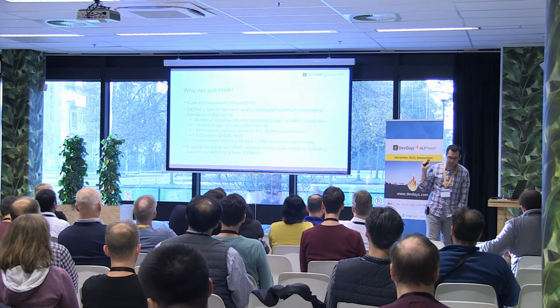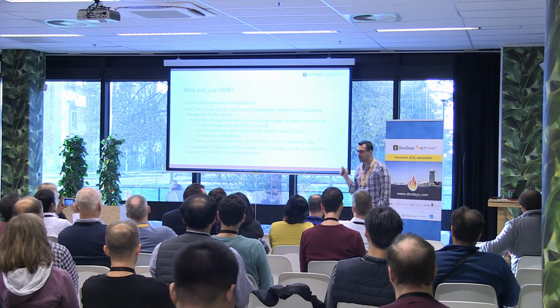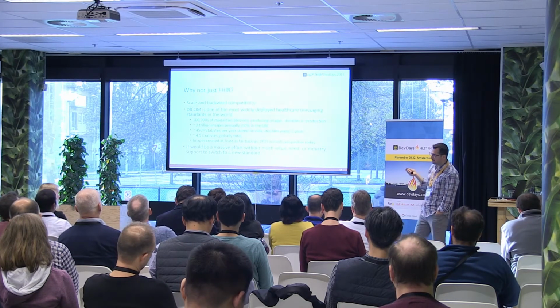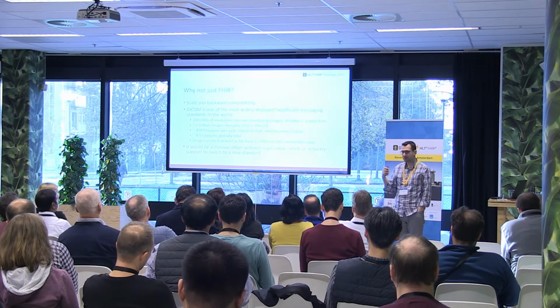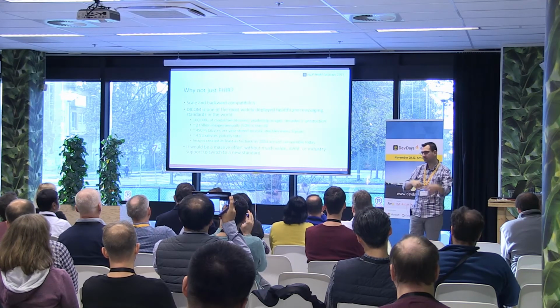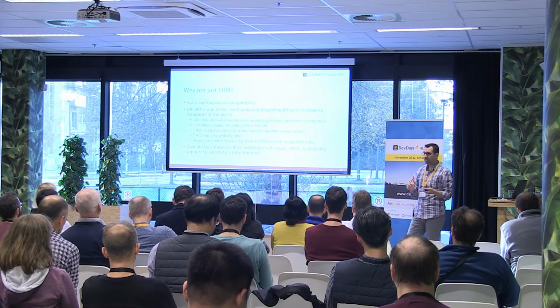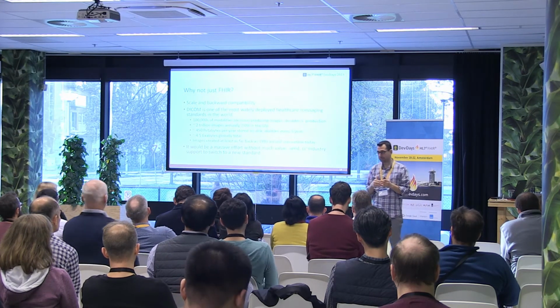Of course, the million-dollar question that I get at a conference like this is, why can't we just put this in FHIR? Like, why couldn't we just store the images in FHIR? A lot of reasons. One of them is, if you think about FHIR itself to begin with, FHIR is a complete reboot of HL7, right? There's no backward compatibility whatsoever between FHIR and V2. You could talk all day long about mapping between V2 or V3 and FHIR, but it's just not the same. Whereas DICOM and the newer version, which is DICOMweb, are 100% backwards compatible.